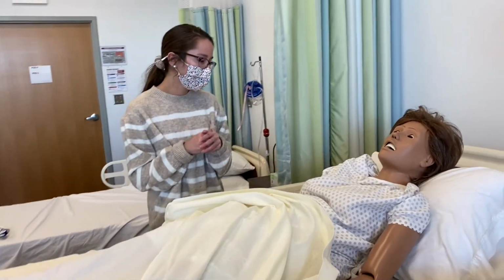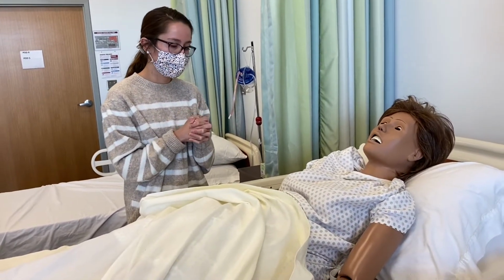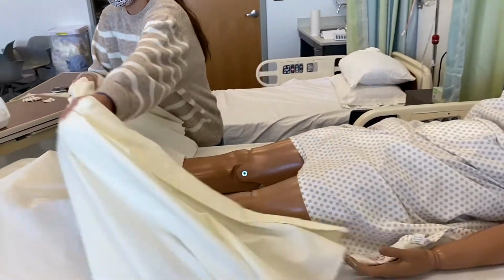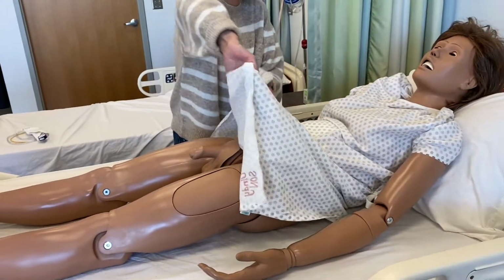Okay, Carl, today I provided privacy by shutting the door for you. This is going to be a little bit of an invasive procedure, and if you feel any discomfort at all, just let me know. I'm going to pull the blankets down over his feet, and then I'm going to pull this up.